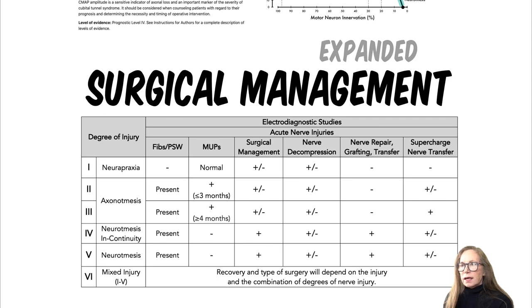But basically, I'd like to just point out that one key point for me in getting good results is being aware that if there are nearby areas of nerve compression in patients with nerve injuries, you should be looking for a positional or some kind of provocative pressure, whatever sign to see if you could decompress at that point.